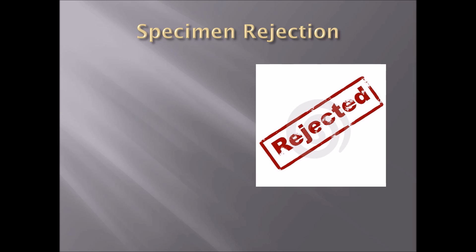Let's talk about why specimens get rejected from the lab. Number one: quantity not sufficient, also known as QNS. This can happen for two reasons — one, you did not obtain enough blood in the tube, or two, there wasn't enough serum in the tube to be tested by the lab. Therefore, it will be rejected and labeled as QNS.